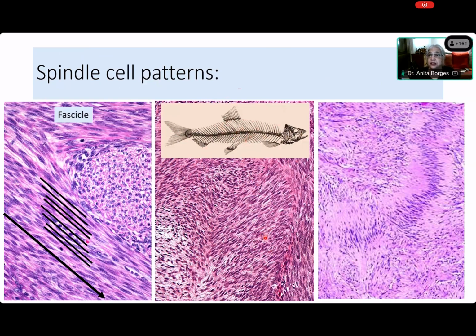Now can you see it? Now can you see it, Diksha? Yes, ma'am. Yes, where? Here, lower down. Very good. That's the spine. Excellent. And yes, and there you are now able to see. Here. Yes, now you can see that these are all the different ribs of that fish that are being deflected away from this thing. So very good. So this is a herringbone pattern.